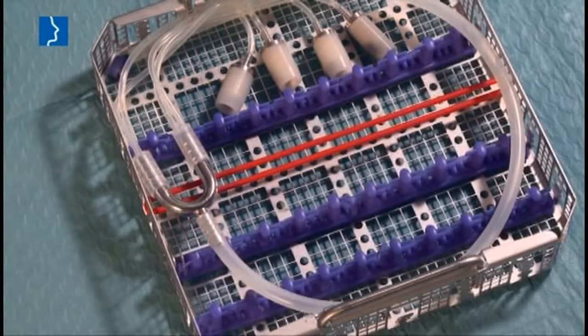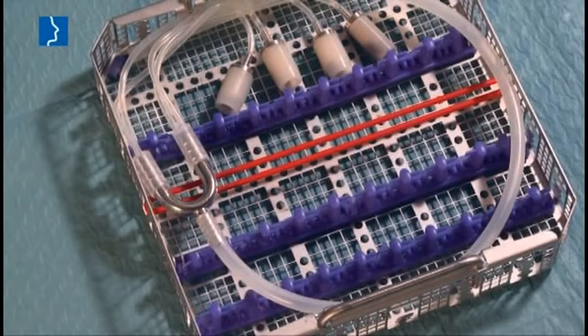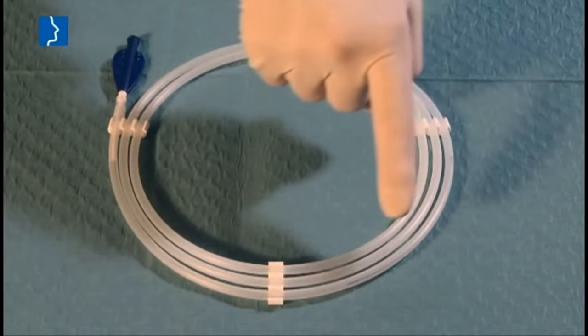A cleaning and sterilization basket is available. And finally, the balloon catheter itself, packaged in a protective tube.